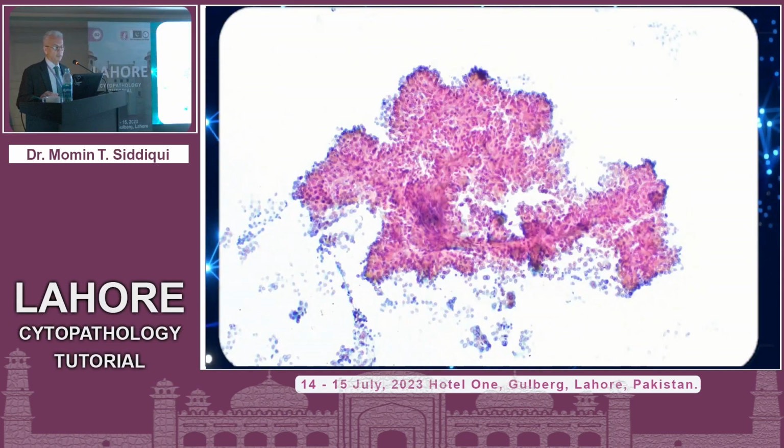So this was the other smear we have. Again, it gives you a papillary configuration. There's a somewhat dense material here too. I don't know what that is. It kind of reminds me of hyalinization, but individual cells are also scattered. Take a look at this group over here. Large tufts here, but the cells at the periphery are giving you a hobnailed appearance and an impression of being slightly smaller.